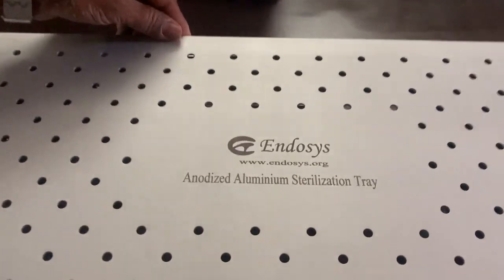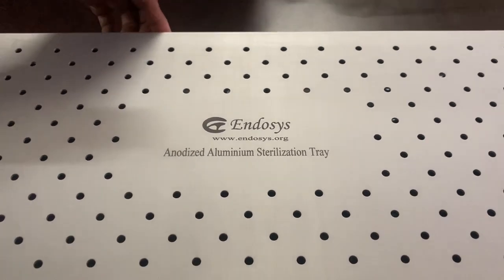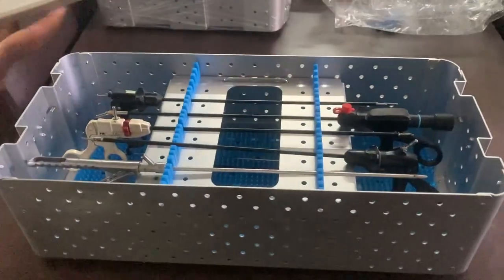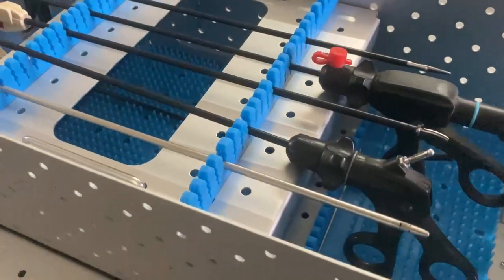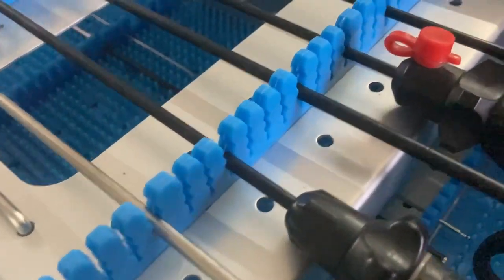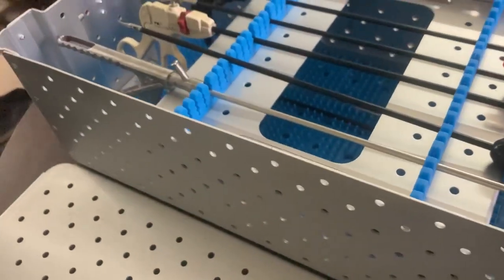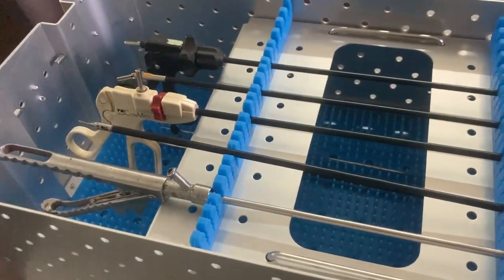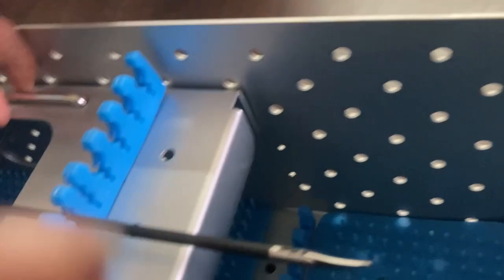This is a hybrid aluminium anodized aluminium sterilization tray for laparoscopy instruments. You can keep different types of laparoscopy instruments with 5mm and 10mm holders. You can keep up to 15 to 20 instruments, and even in the bottom you can also keep instruments.